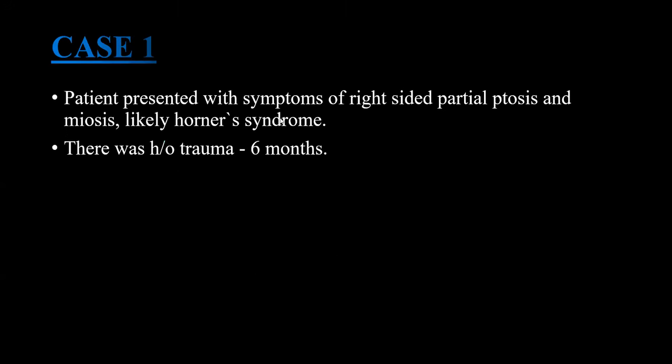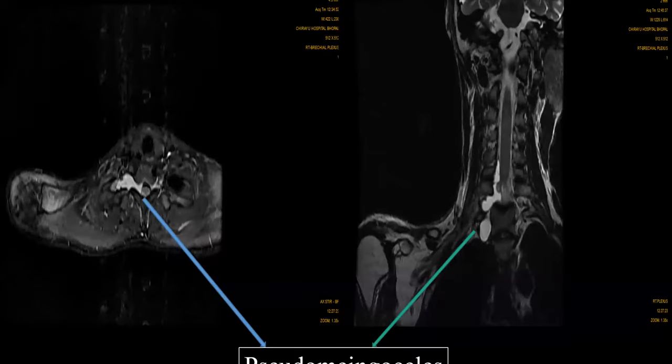Case 1: Patient presented with symptoms of right-sided partial ptosis and miosis, likely clinical diagnosis of Horner syndrome, with history of trauma 6 months prior. On MRI, you can see pseudomeningocele formation noted at C7, C8, T1 at the level of the neural foramina, suggestive of pre-ganglionic nerve root avulsion injury.